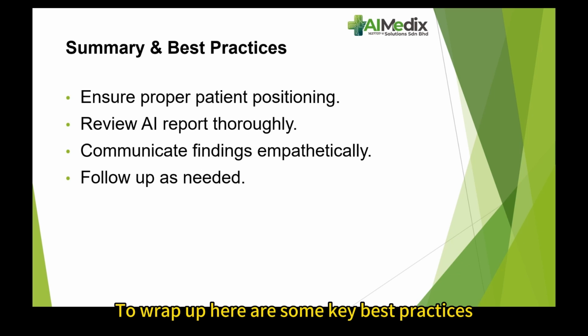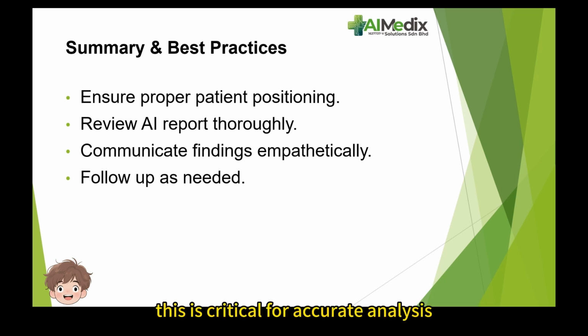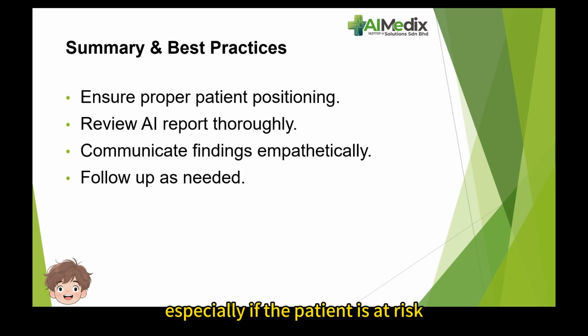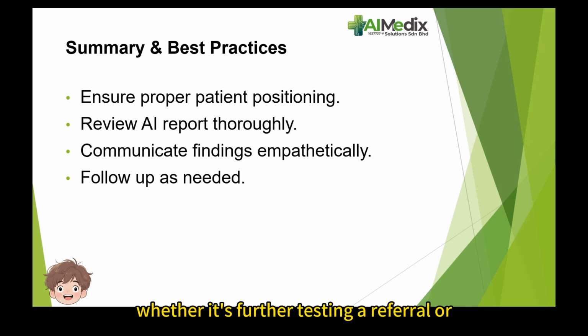To wrap up, here are some key best practices. First, always ensure the patient is properly positioned. This is critical for accurate analysis. Next, take time to review the AI-generated report carefully, understanding its findings and limitations. It's also important to communicate results with empathy, especially if the patient is at risk. And finally, always follow up appropriately, whether it's further testing, a referral, or lifestyle guidance.